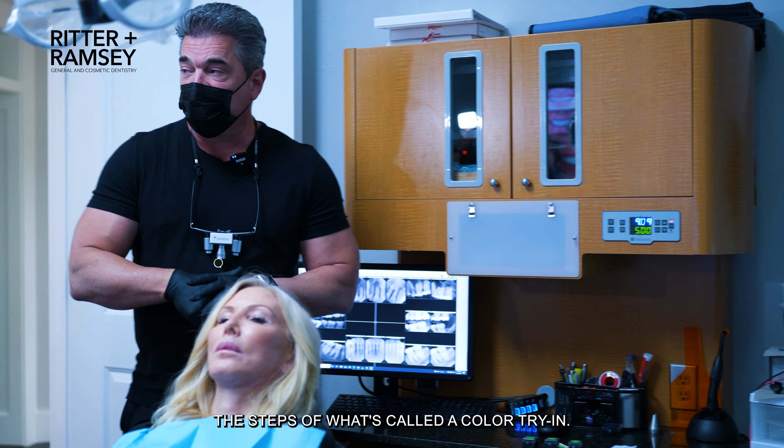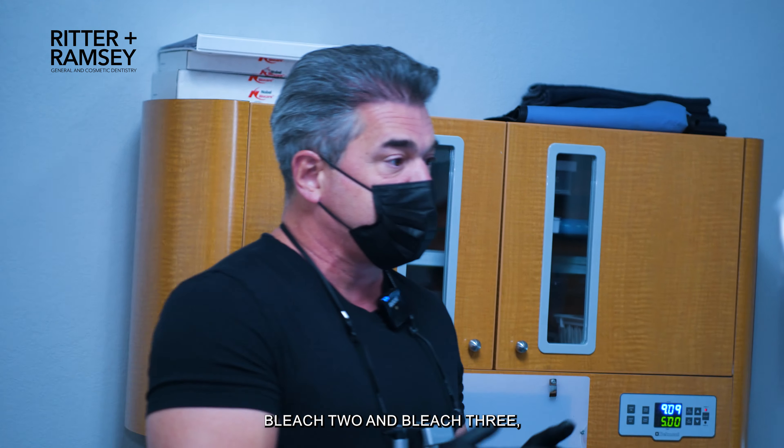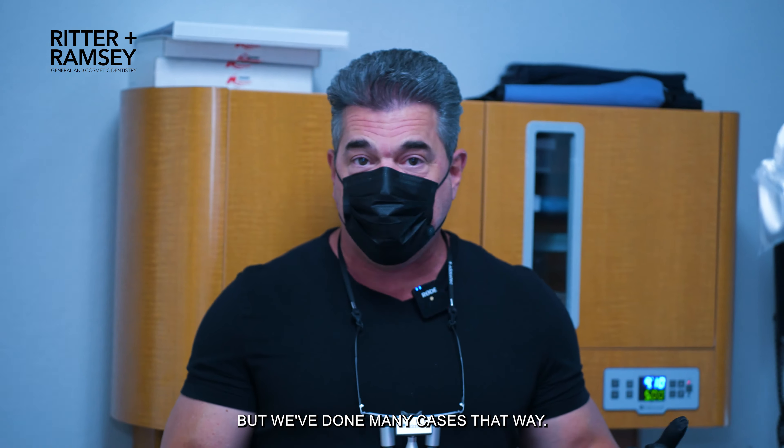We've also introduced the step of what's called a color try-in. We offered her Bleach 2 and Bleach 3, but then she did reach out to me personally and said she was thinking about checking out BL1. I shared with her it's a pretty light color, but we've done many cases that way.